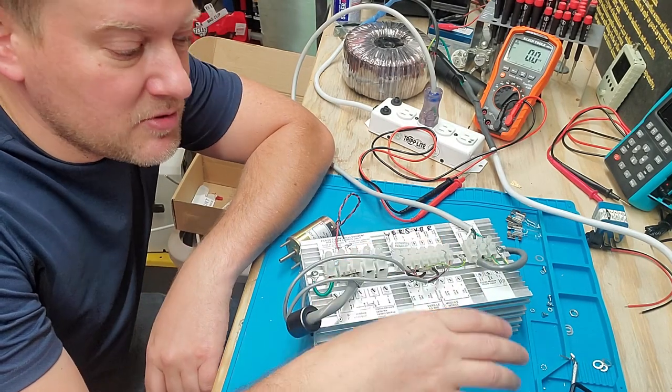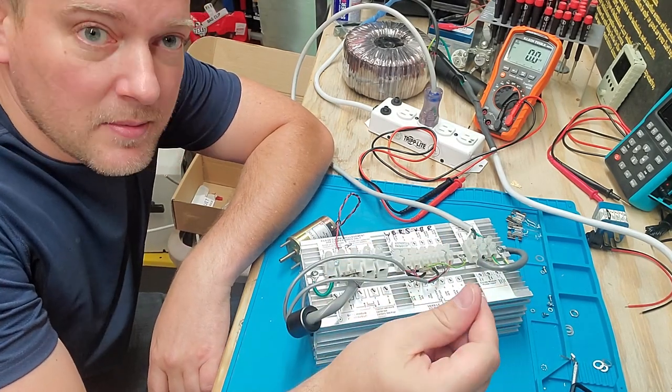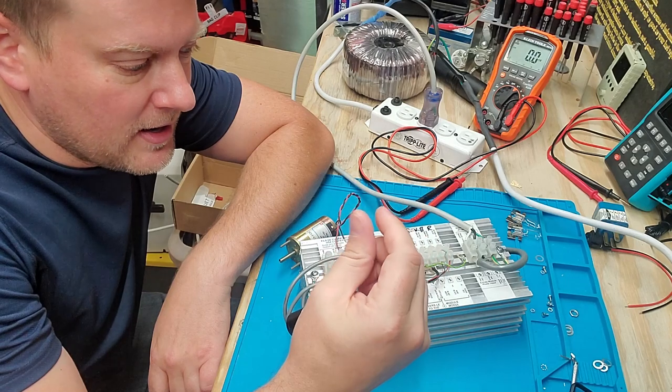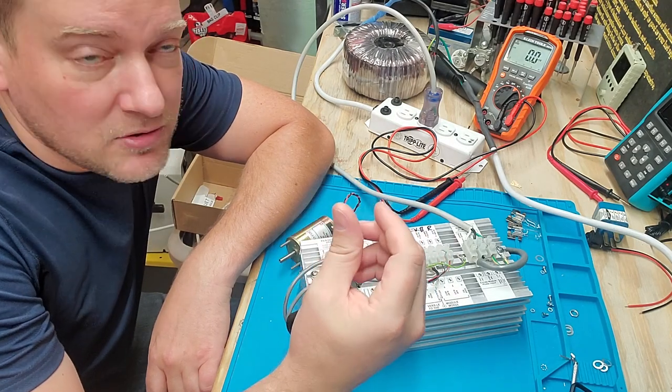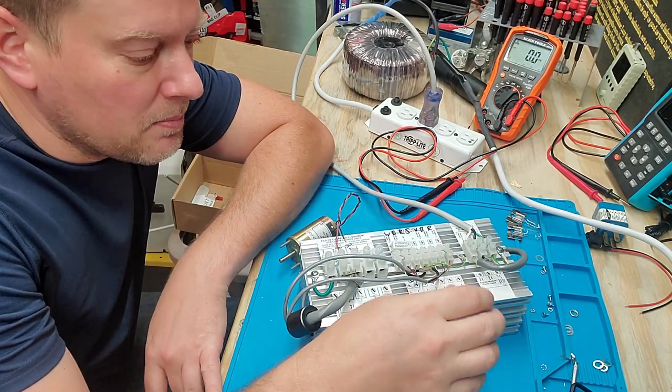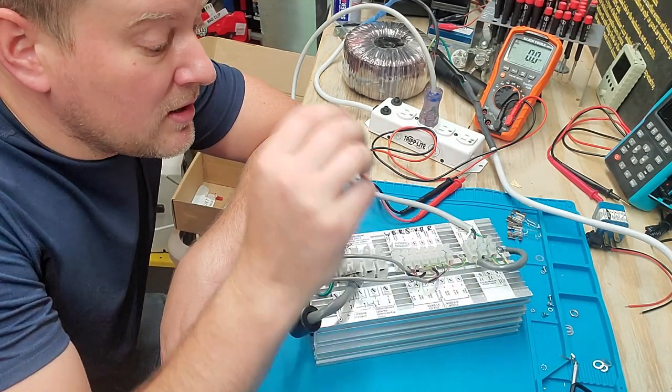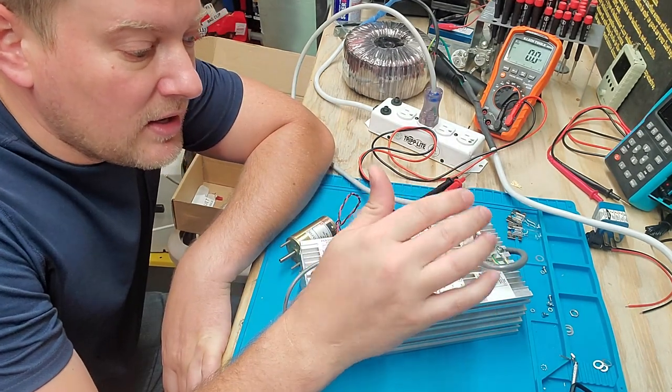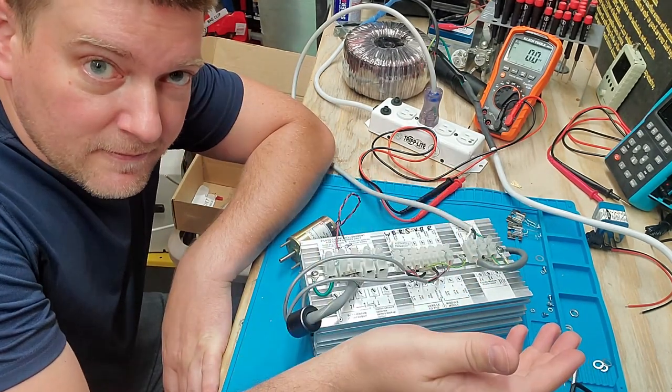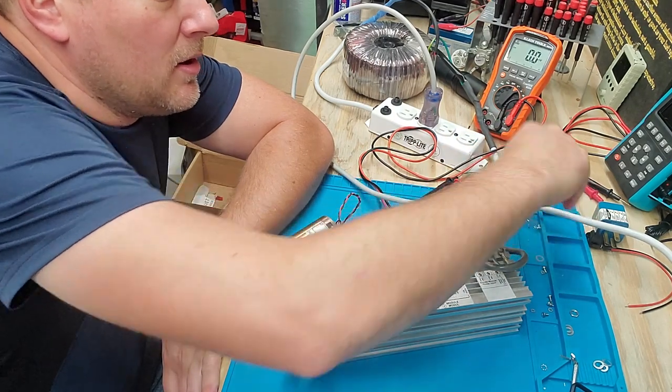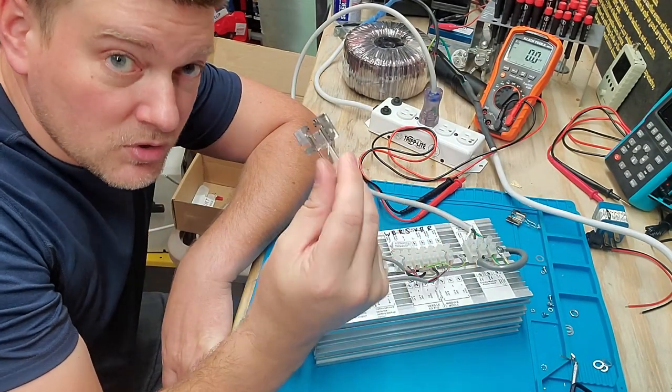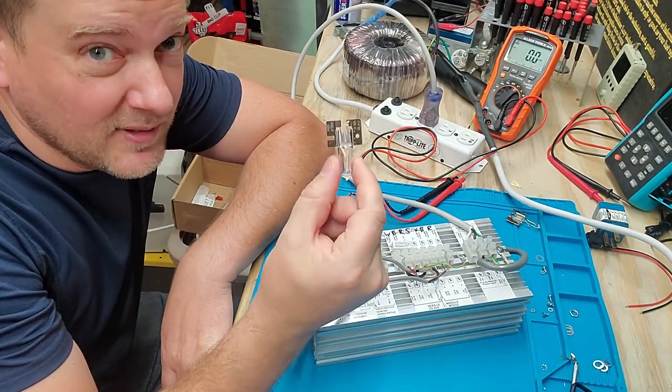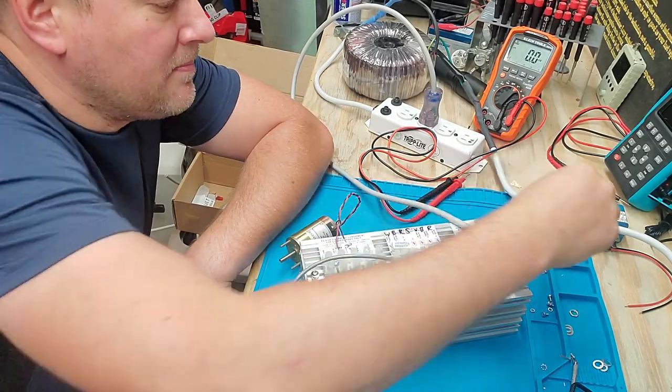volts don't equal amps. And what we have to demonstrate this is a power supply that comes out of a surgical light. It came out of an operating room and this particular one showed that it had voltage but yet it wouldn't light up a little bulb like this, which should take little to nothing to light this bulb up.